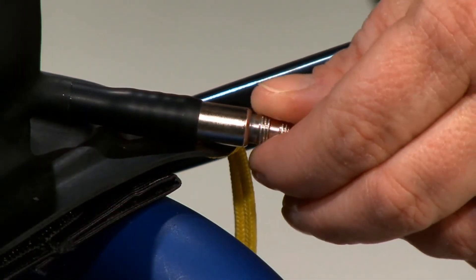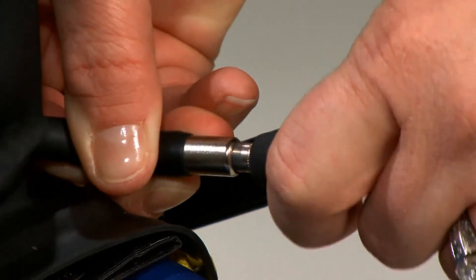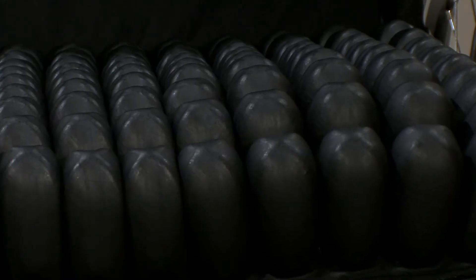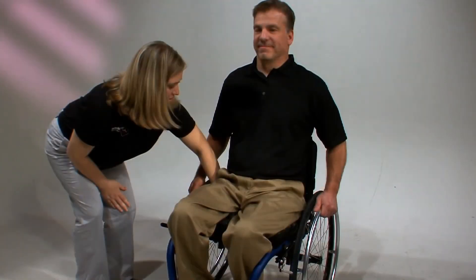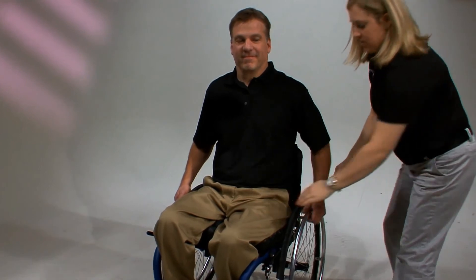Now let's show you how to use the Isoflow control to correct a posterior pelvic tilt. Start with the steps for proper inflation, but for this type of correction, keep more air — approximately 1 inch or 2.5 centimeters — under the pelvis. Have the caregiver lift both of the individual's knees to put more pressure on the pelvis. This forces air to the front of the cushion, creating a well for the pelvis and helping to block the pelvis from sliding forward. Recheck each compartment of the cushion to ensure proper inflation.